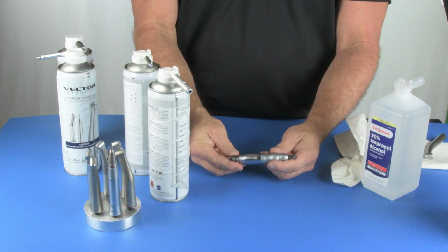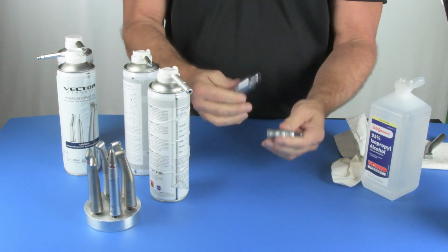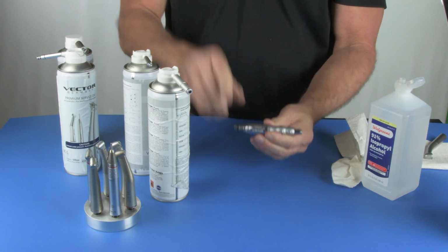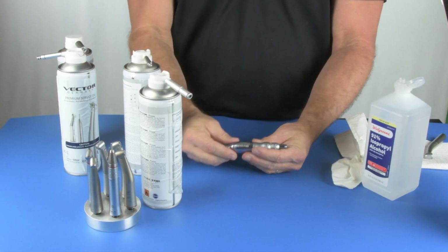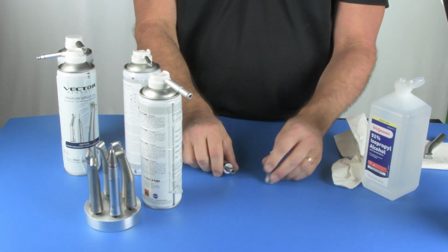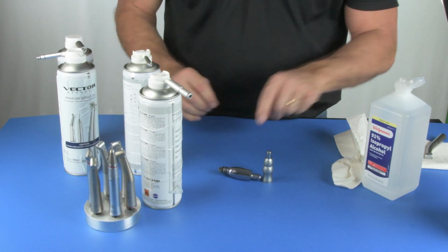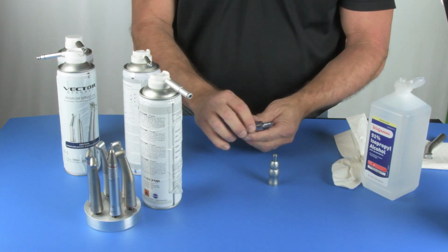Hygiene handpieces come in all types. Some have removable nose cones and some don't. But we're going to assume that they both have it, and we're going to show you how to do each type. So we're going to start out with, if it is the type that comes apart, you want to take the nose cone off separate and have the motor separate, and you're going to lubricate them separately. You cannot lubricate them in one piece. It does not work that way.